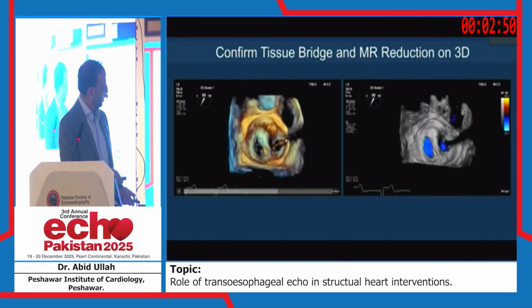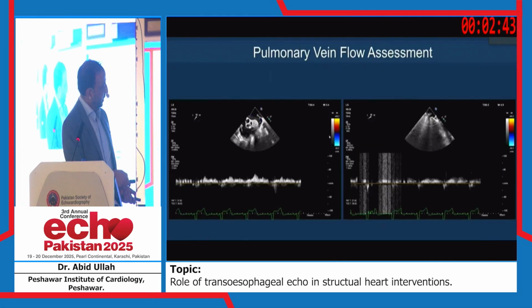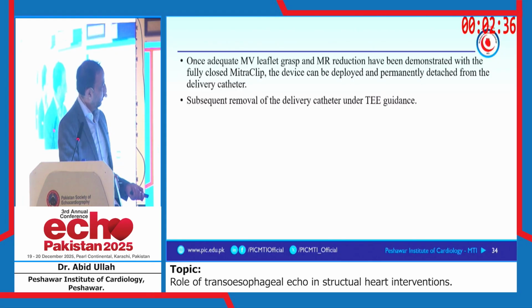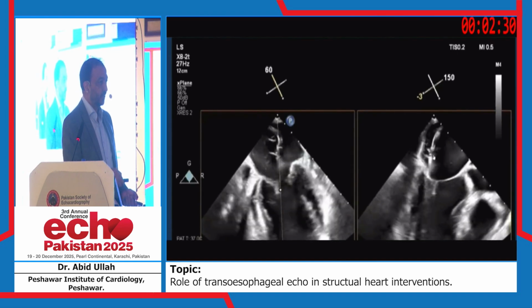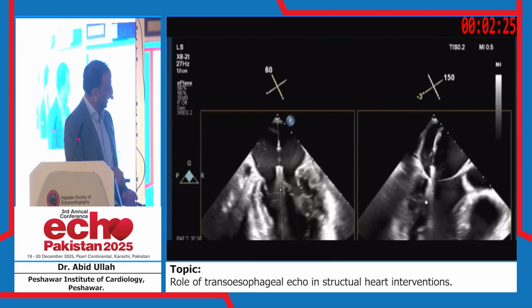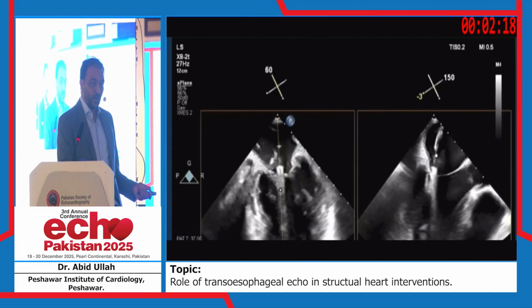And that's where it is shown. You have got your clip there, the mitral regurgitation, which was there anteriorly, and then also the imager guides the implanter that they are happy, and the implanter would go ahead and release the clip. So the clip cannot be released without the imager telling the implanter that now they are happy with the position. So under TE guidance, they will release the clip, the delivery system will be removed, and that will be a point of no return there.